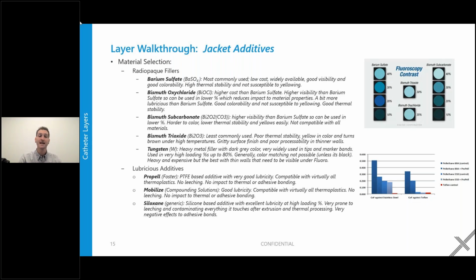So then we go into lubricant additives. I like Propel. I'm partial to Propel. It's a Foster product. The biggest reason for that is it's PTFE based. It's very inert. It has a high compatibility with almost all materials. It doesn't leach. It doesn't leave residue. It doesn't cause bonding issues with other materials or with adhesives. And it's got very high lubricity compared to some of the other options out there. So it's one of my favorites.